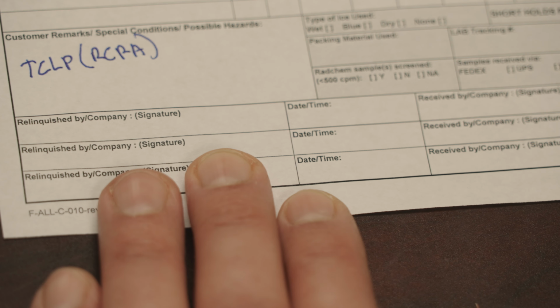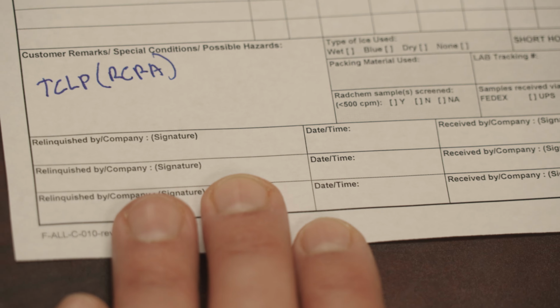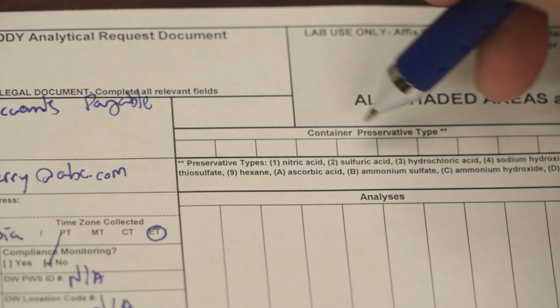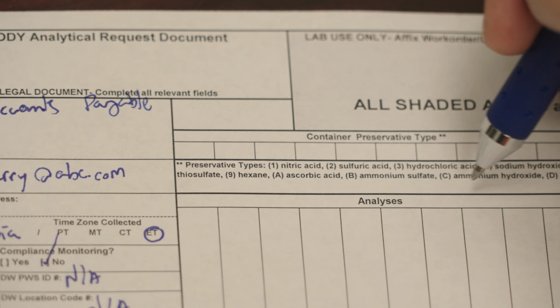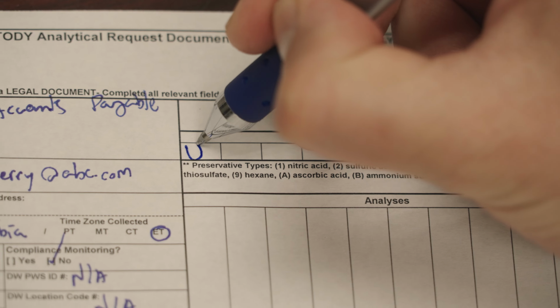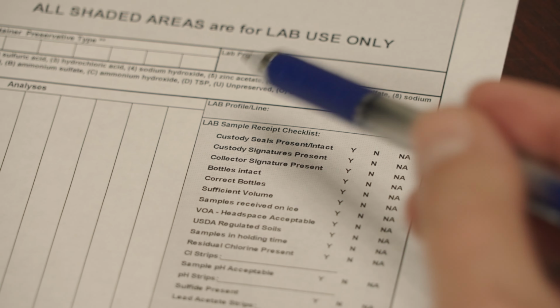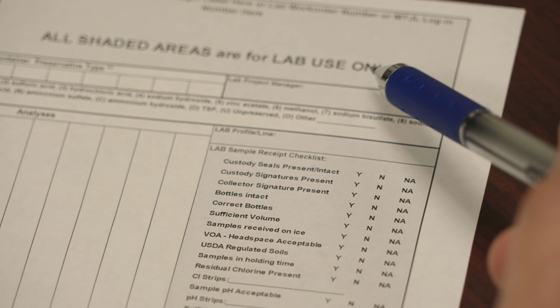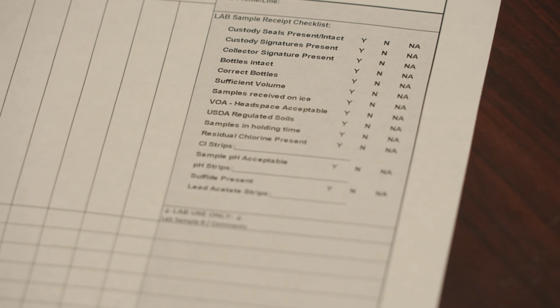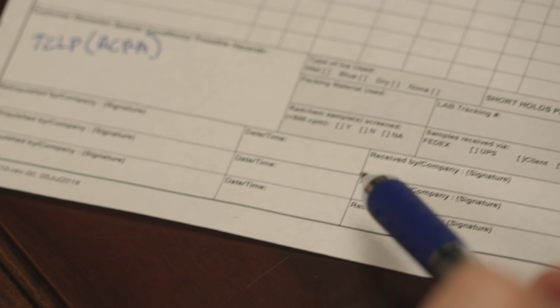And also, we know that this does not need a preservation. And then we're going to tell the laboratory if this chemical sample is preserved or not. There's the types of preserved. In this case, it's unpreserved, so we're going to put a U in this box. And as it states here, all the shaded areas are for the laboratory use only, so we will leave the shaded areas as they are. Again, when the sample ships, we will complete this bottom section, and then this is good to go.